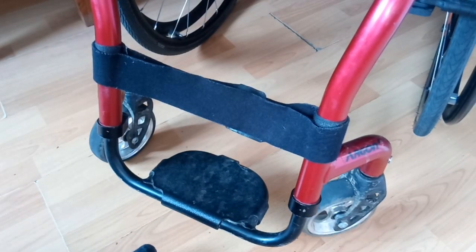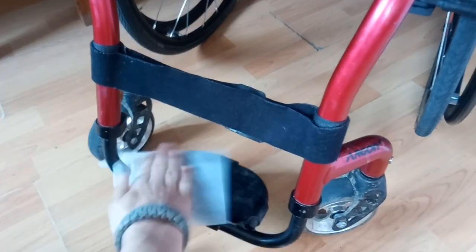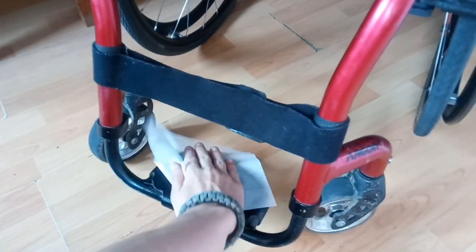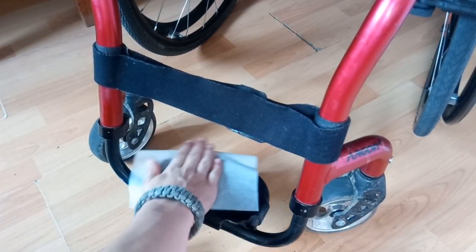But yeah, they're muddy as fuck, and need to be cleansed of their sins. So first what I'm going to do is just clean the foot plate. Again, it doesn't really need to happen, it's under my feet most of the time, but it's still a small detail that I will notice and will be bothered by.